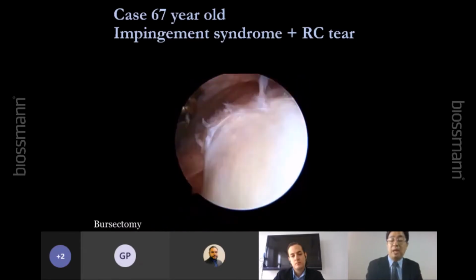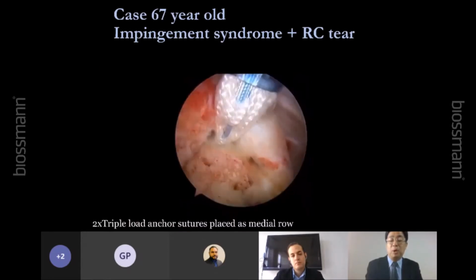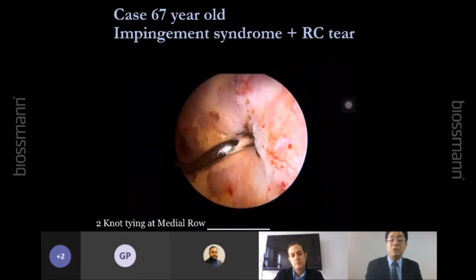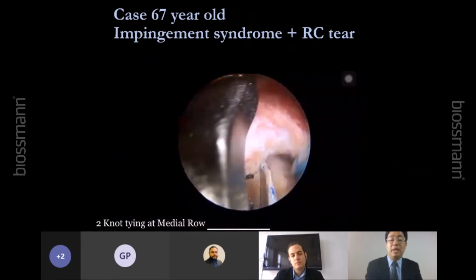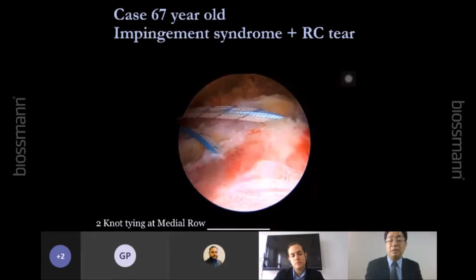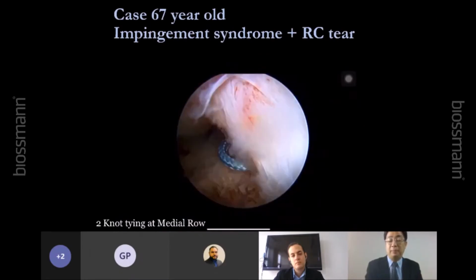And then we do the cuff repair. So this patient has a small size tear. So we make a microfracture at the footprint to promote healing. Then we put 2 anchors at the medial row, okay? I prefer the triple loads, okay? And then we pass the sutures, 3 sutures into 1 hole, right? 1, and then the second one. The distance between each hole is about 8 millimeters. I will not put it too close because from the article we found that if you put it too close, like 5 millimeters, you can cut through the tissue, right?